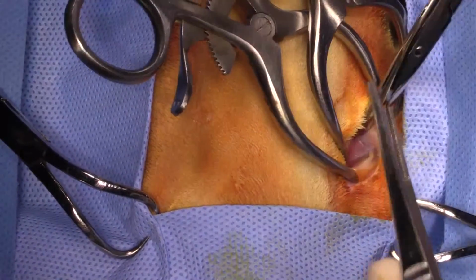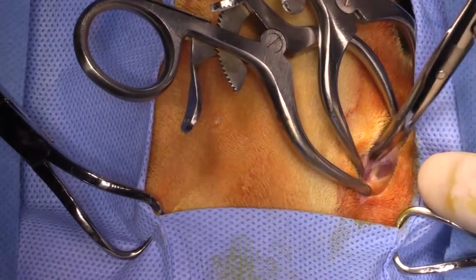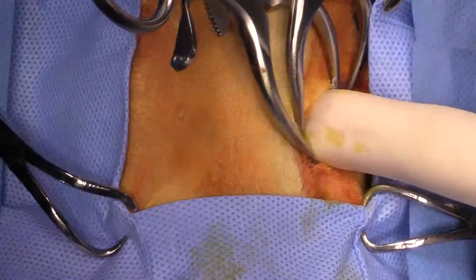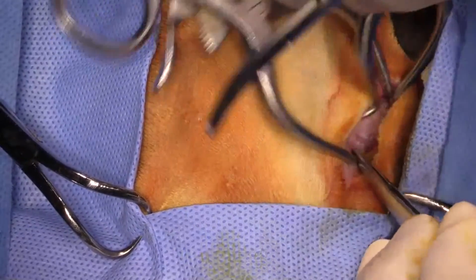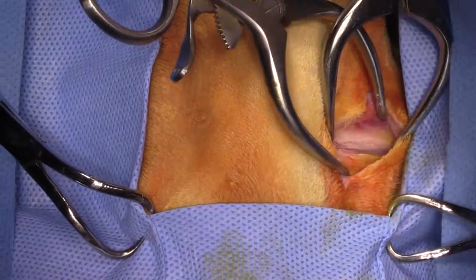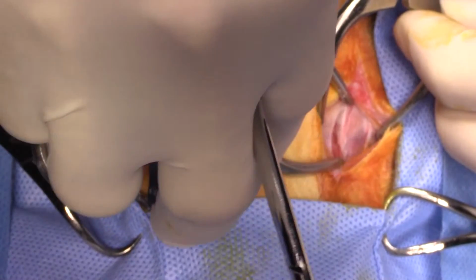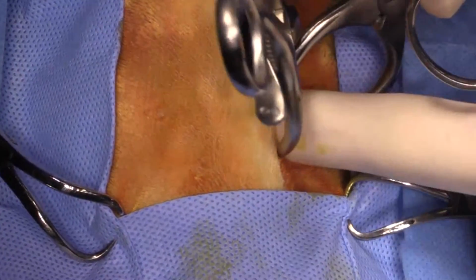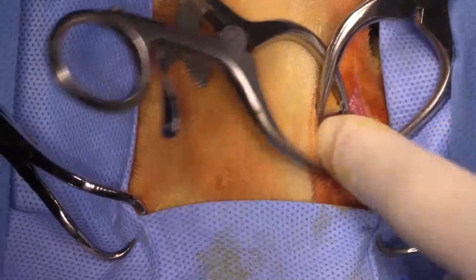You have to be careful, and I've actually made that mistake in that I'm palpating the ramus, vertical ramus of the mandible. The bulla is actually back in here. So that's the first thing that you need to be aware of, is that you can inadvertently approach the ramus of the mandible instead of the ventral bulla, and that's something that you want to watch out for as you're making your dissection. So the bulla is actually right back in here.